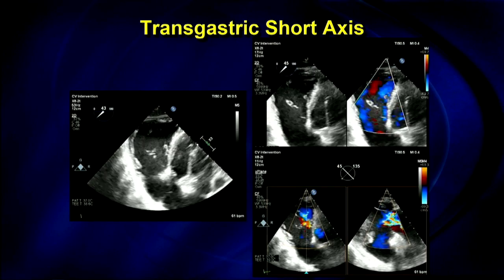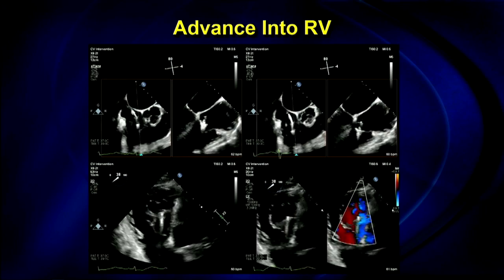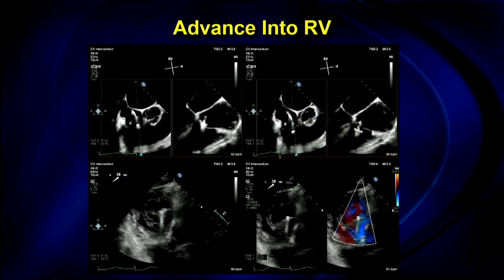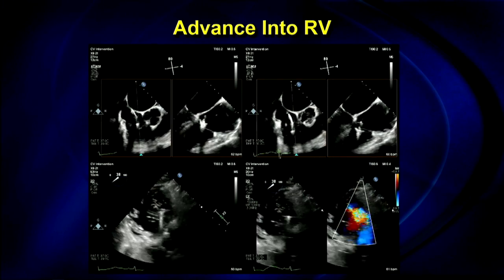So based on that, we direct our therapy, we get the clip into the RV, and because of the shadowing with multiple clips, we decide to put this first one more anteriorly. We push it a little bit forward, and we just want to be on just the anterior side of that cleft.